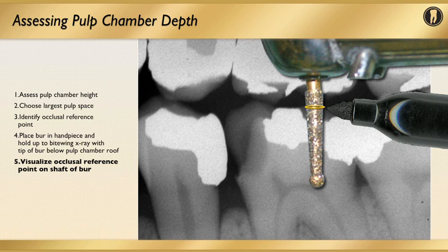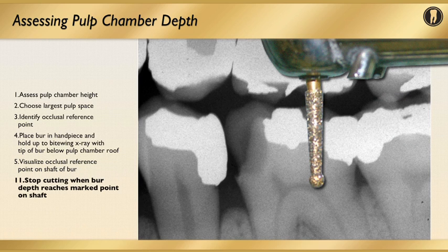And lastly, once we penetrate to that depth, we want to stop apical progression of our preparation process. Violation of this needs to be considered an error. Violation, contamination or destruction of the pulpal floor and the furcation area of the pulp chamber is something we want to stay away from, and we must always strive to maintain the natural anatomy of the pulpal floor and not violate the furcal area.